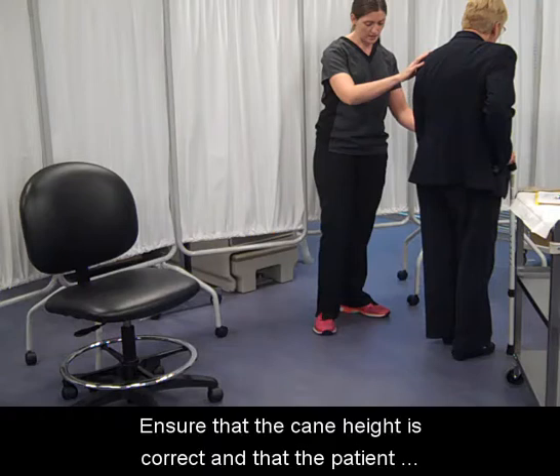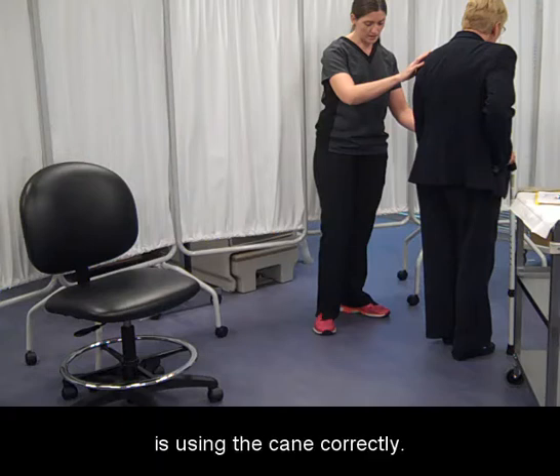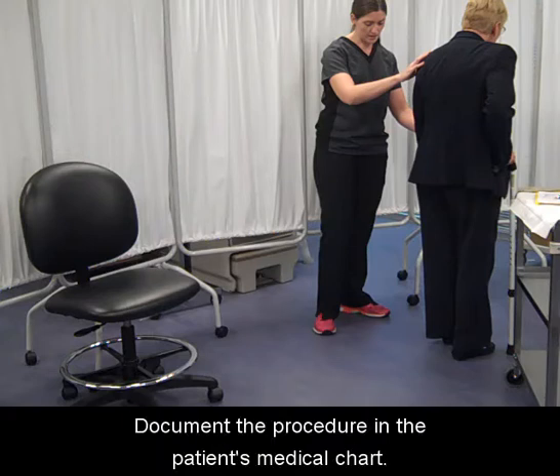Ensure that the cane height is correct and that the patient is using the cane correctly. Document the procedure in the patient's medical chart.